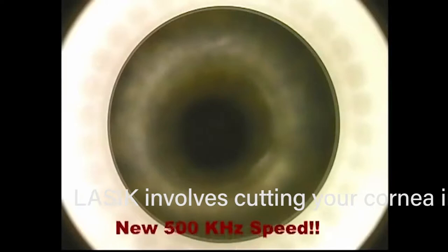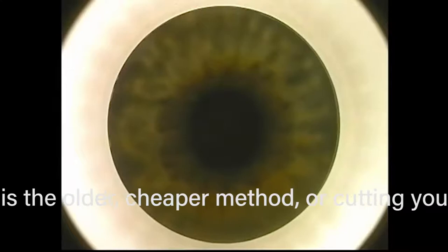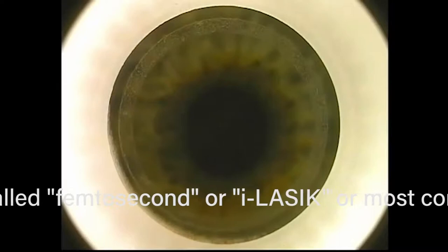Now we're going to show you a laser cut flap. They call this bladeless LASIK, but it is with a laser. It's cutting a flap using a femtosecond laser — that ring you saw is the laser creating little bubbles in the cornea that connect to form the flap. This is called bladeless LASIK, also called I-LASIK or femtosecond LASIK, and there are many different lasers now that can do this.